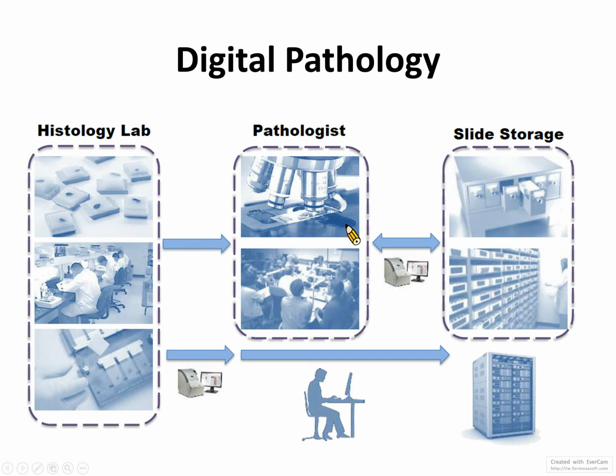So probably no one will want to dump these slides just because they are very old. But imagine a very big hospital, for example, the National Taiwan University Hospital or the Taipei Veterans General Hospital. They would need a large storage space to store these pathology slides.